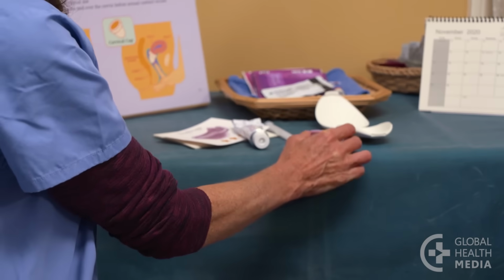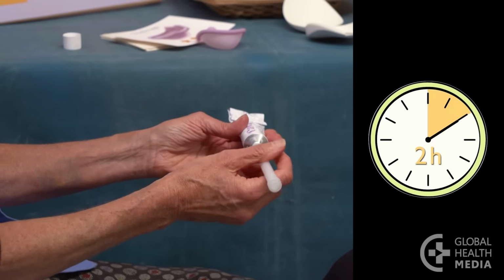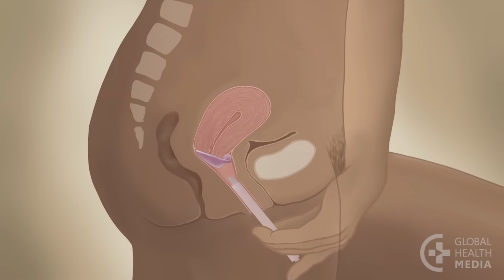You're now ready for sex. If more than 2 hours passes before you have sex, be sure to put more contraceptive gel inside your vagina with the applicator. And you don't move the diaphragm.